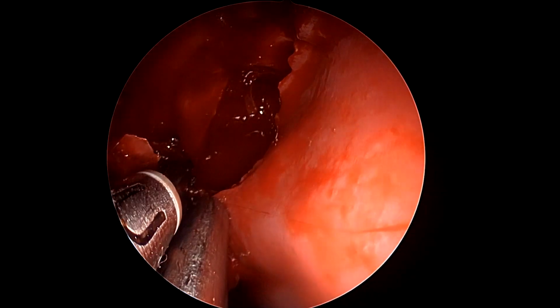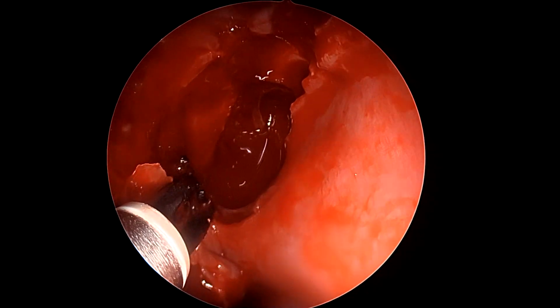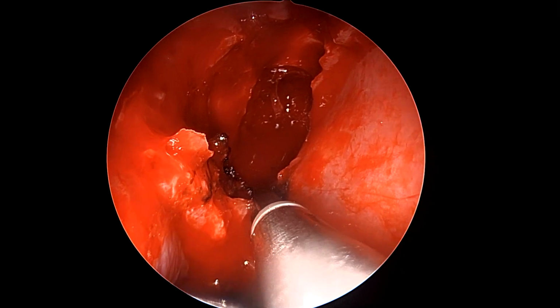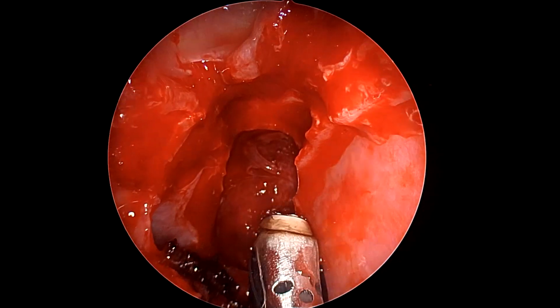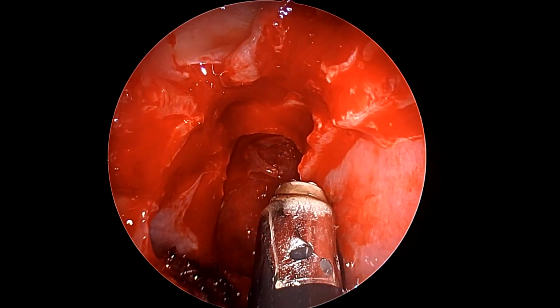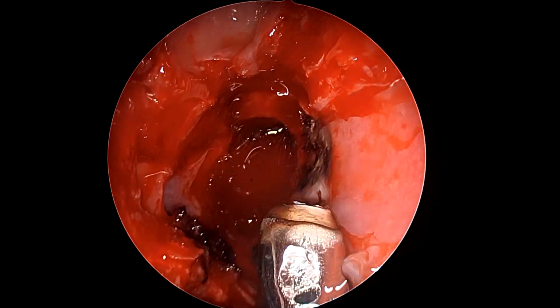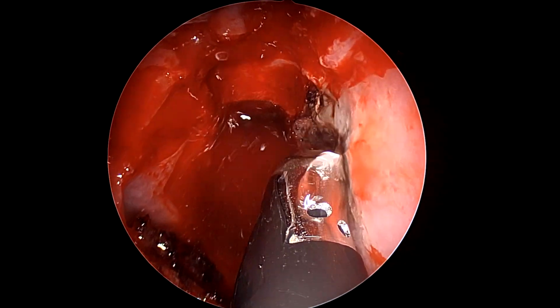Using the bipolar, we coagulate the septal branch of the sphenopalatine artery that comes on the anterior face of the sphenoid. Here on this side, we will be lowering the face of the sphenoid much more, so we need to occlude this vessel for complete visualization. As of now, we do not have any plans for any flap raising on the right side. If need be, we can do it on the left side to close here. Also, because we want lateral exposure, we are not contemplating any flap raising on the right side, because we have to go laterally, even sometimes to the extent of the pterygoids, to gain sufficient exposure.